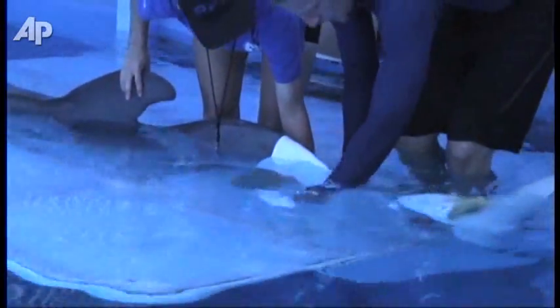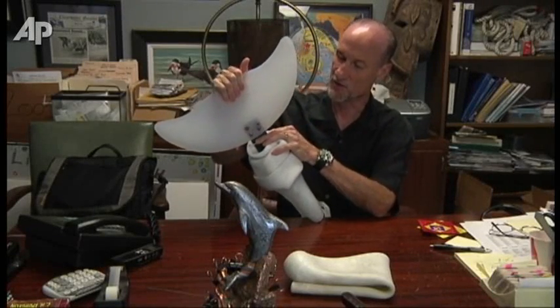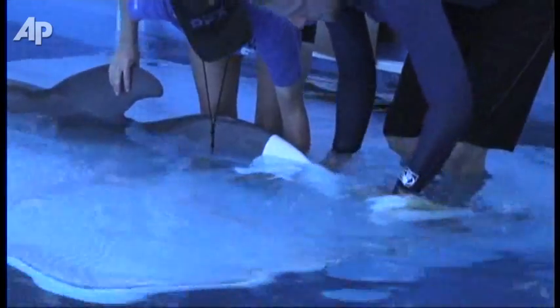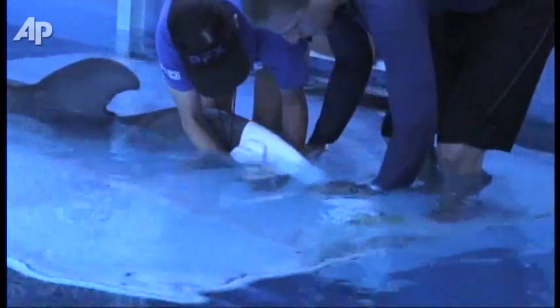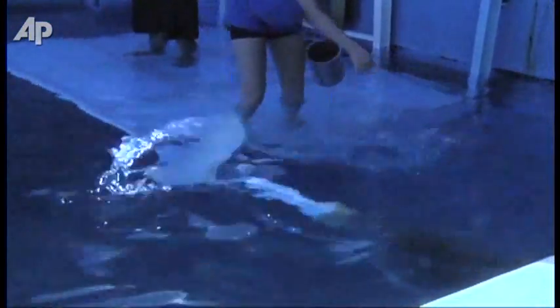What she doesn't have that's new is obviously this area right here, which is the tail fluke — and this is what we've built. It's a great challenge because it has to duplicate the exact buoyancy of a dolphin's tail. It has to move up, down, sideways. It's an amazing device. She loves it, it does well, and she's wearing it more and more every day.